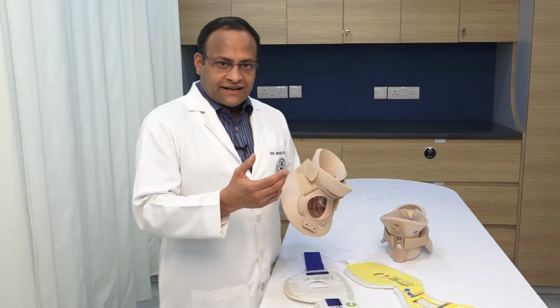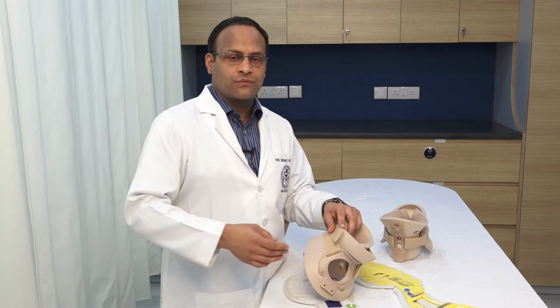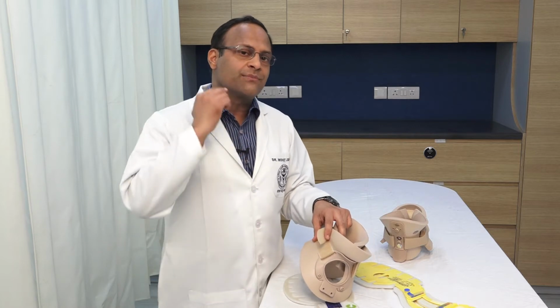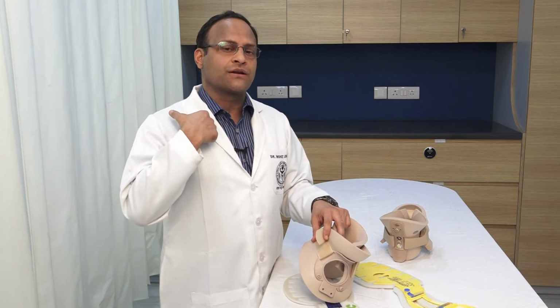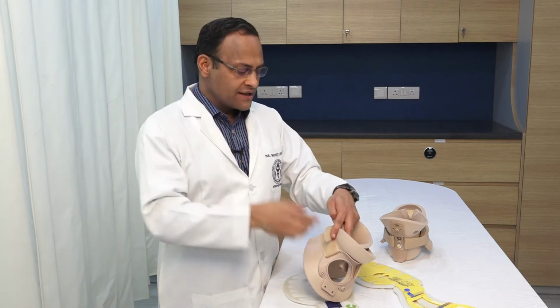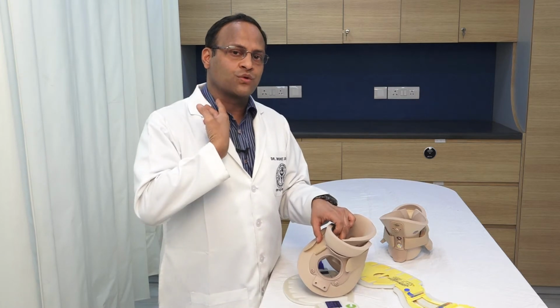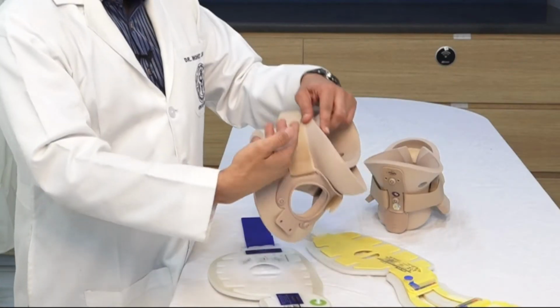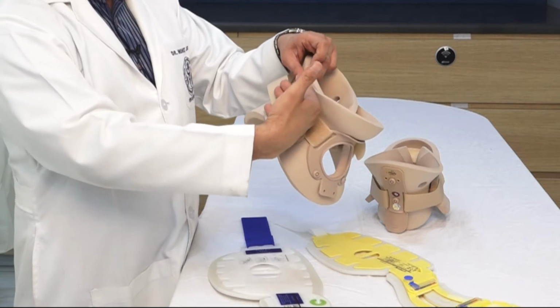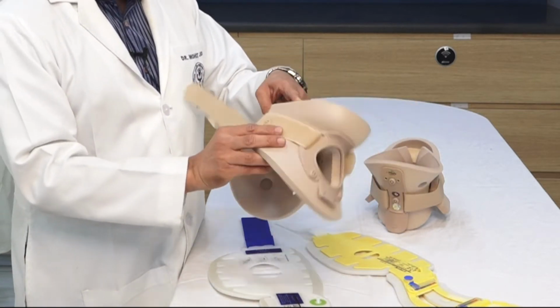Now, how to select an appropriate size cervical collar? We have to gauge the distance between the patient's lower jaw and the upper part of the shoulder, and we can gauge it using our fingers. If I measure the distance between the patient's lower jaw and the upper part of the shoulder, then this should match the side part of this cervical collar. Now in the prefixed one, we can determine the size.